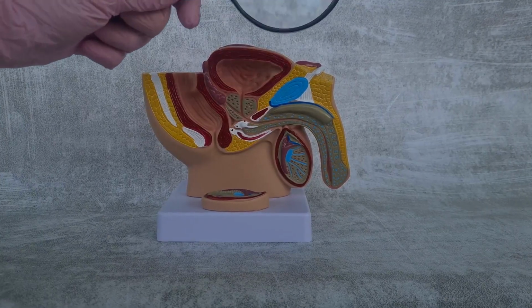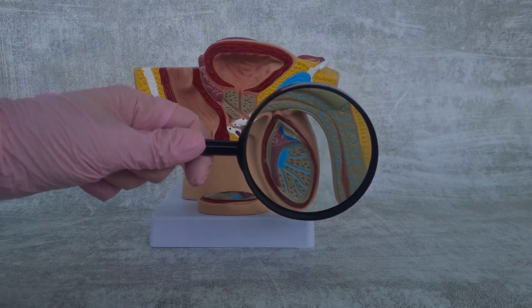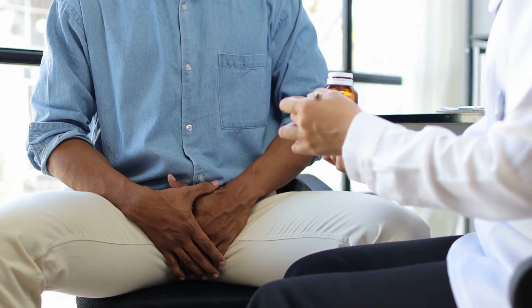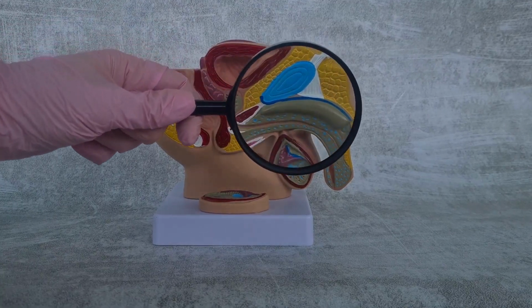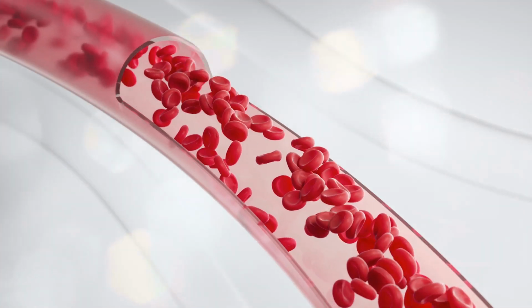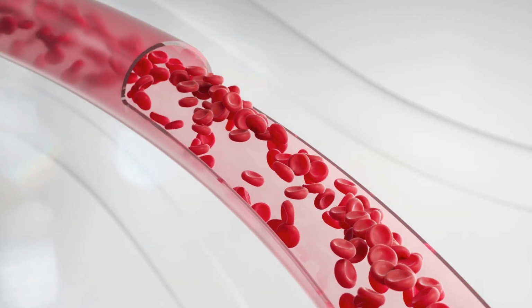Corpora perforation. Due to the presence of significant corpora fibrosis, during dilatation to place the cylinders, the corpora can be disrupted and be exposed to the urethra or the perineum. During the surgery, if it is not possible to repair or the presence of fibrosis makes it more challenging to place the cylinder properly, increasing the possibility of further complications, it could be decided to leave one cylinder only, which is still functional to have erections for sexual activity.